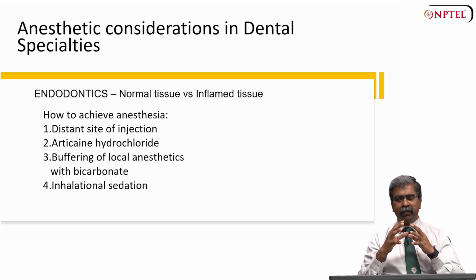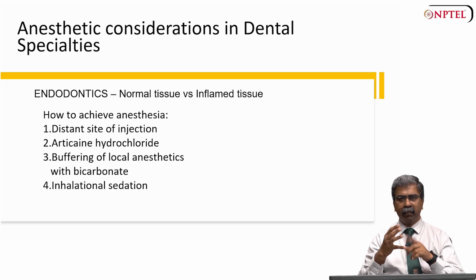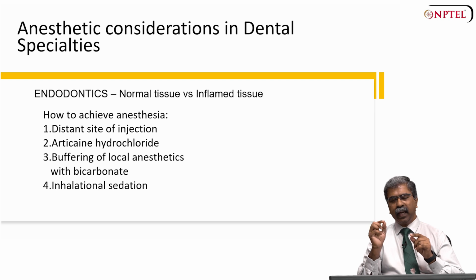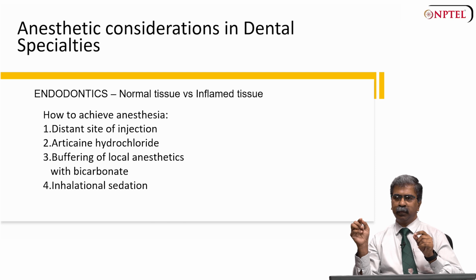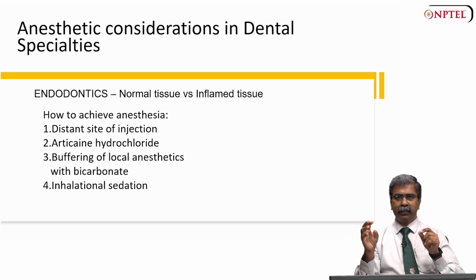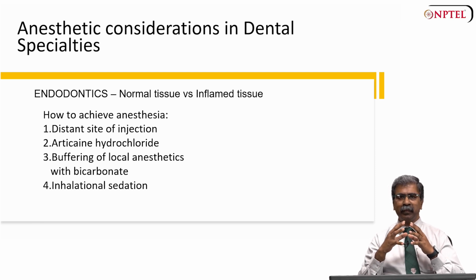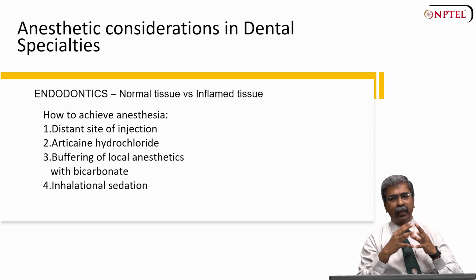Now we have seen all the techniques for mandibular anesthesia. I would like to highlight a few points in particular for the other specialties, endodontics, pediatric dentistry, prosthodontics, and periodontics, where certain modifications to the technique can be made to ensure proper anesthesia.